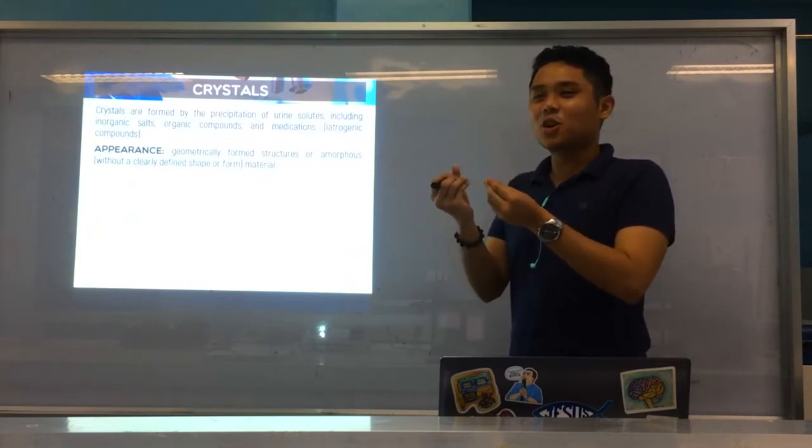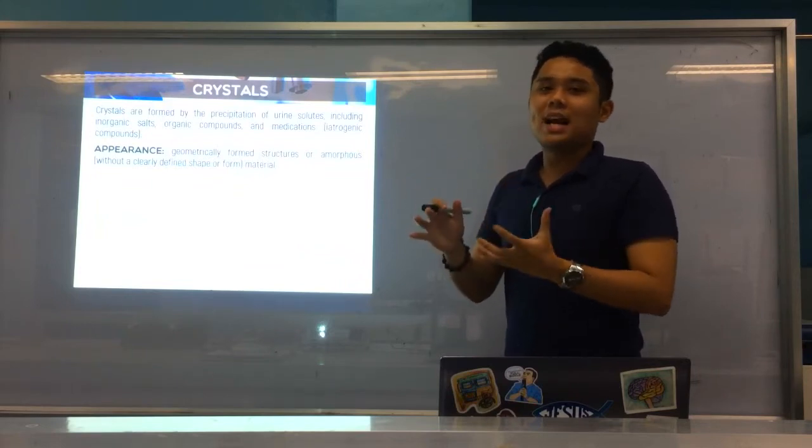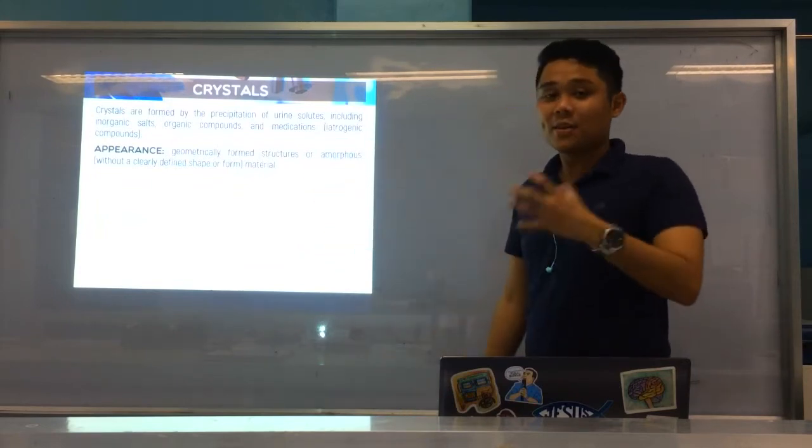So, they have no grains or granules. They have no definite shape.